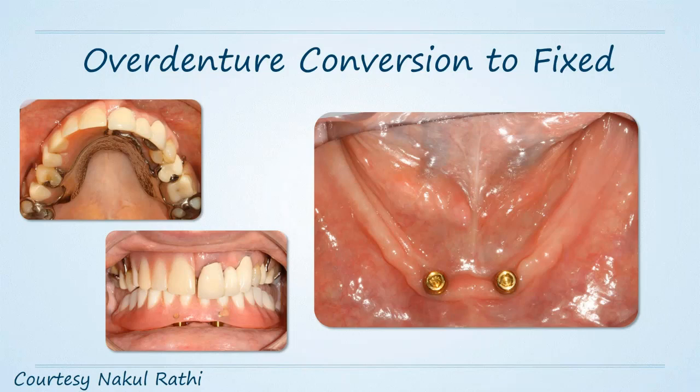And he had a patient where 2 implants were placed at the B and D position because the patient was thinking, hey, could I put 2 implants in now, and maybe do a fixed bridge later if I really want to? Maybe I don't really like this overdenture. Absolutely, that's what happened here.